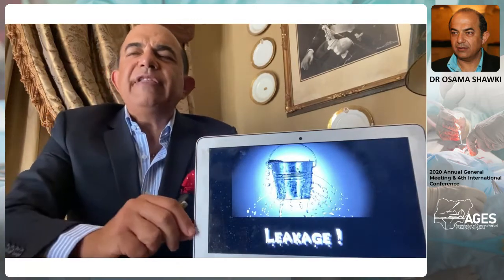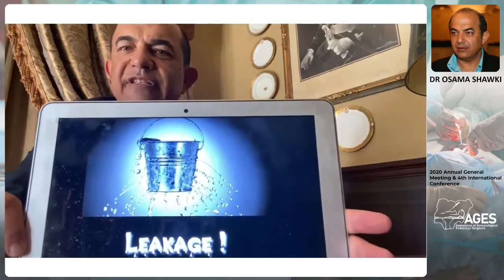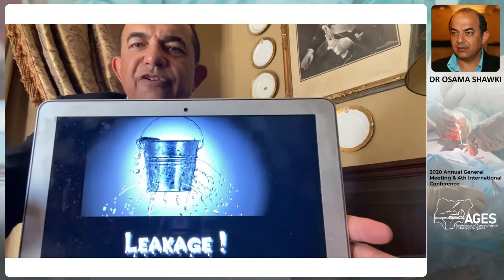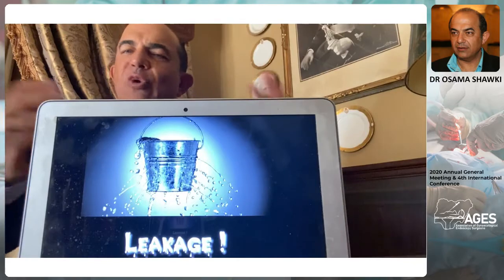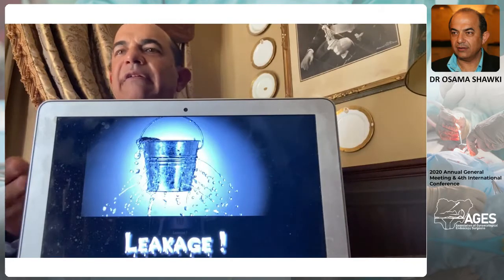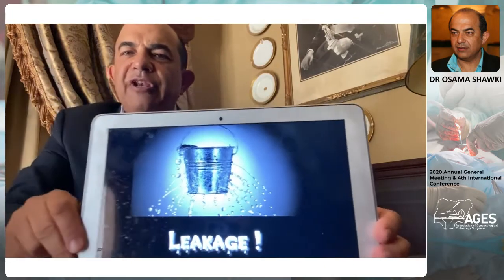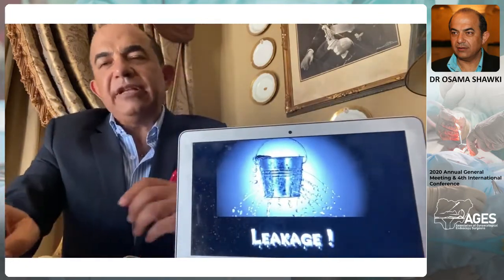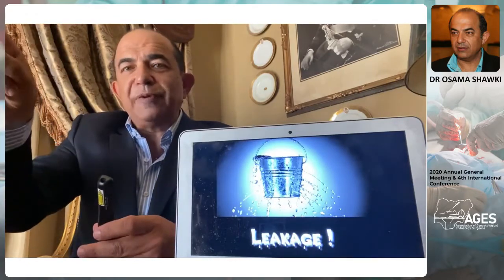We have to agree that in hysteroscopy, there is a lot of challenges to achieve distension. Sorry, it is reversed because of leakage. In laparoscopy, there is no leakage of carbon dioxide that can affect visibility or can lead to deflation and collapse of the belly. But in hysteroscopy, you have leakage from the cervix, from the fallopian tube.